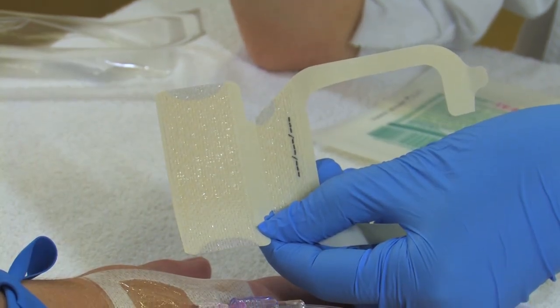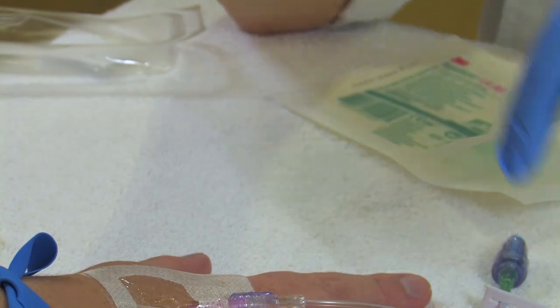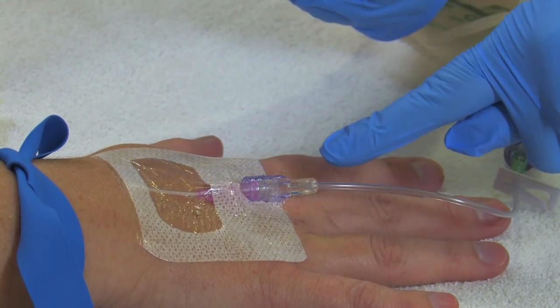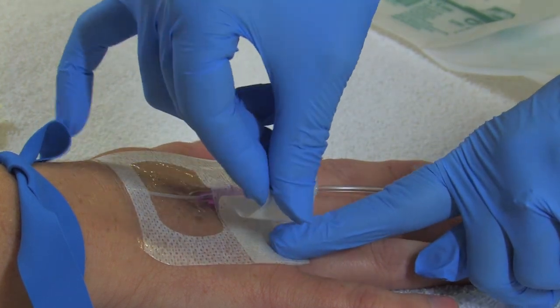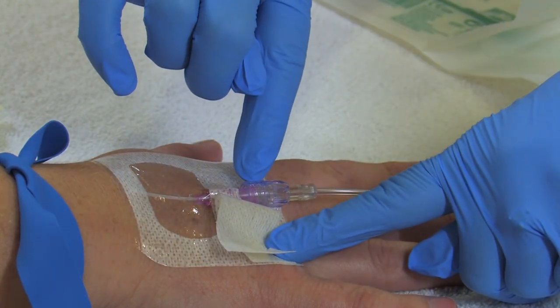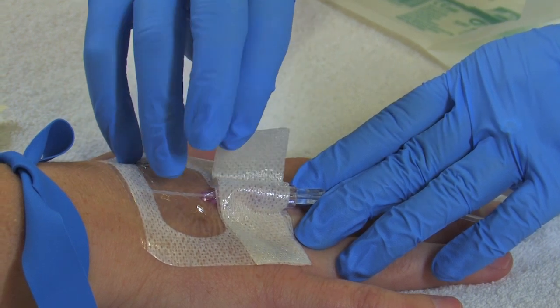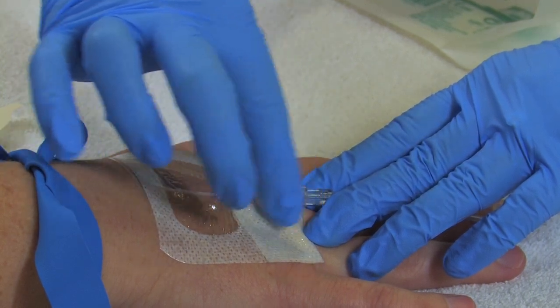Next, we want to take the Securement tape strip and remove it so that we can apply it over the hub of the catheter. So we want to line up the edge here with the edge of the adhesive on the main window. So we line it up at the very edge, and we bend it back all the way to the edge of the hub. I'll move my hand so you can see all the way to the hub. And then we want to carefully go over the hub all the way to the other side to create a nice little cover. We want to pinch it down so it's nice and taut.